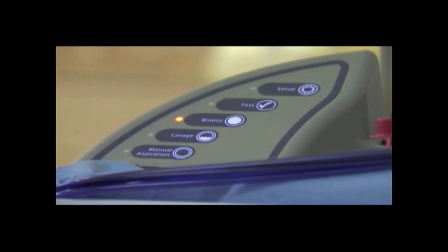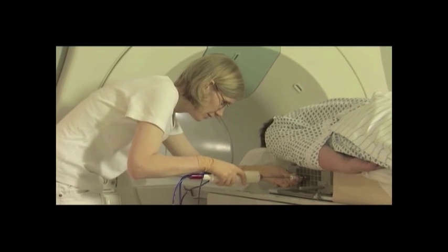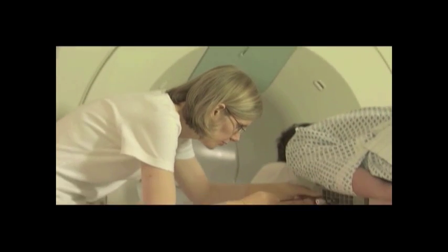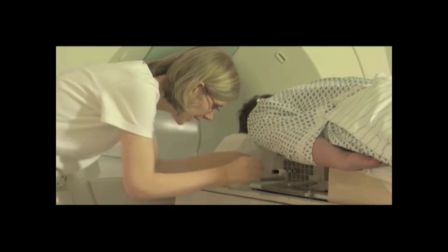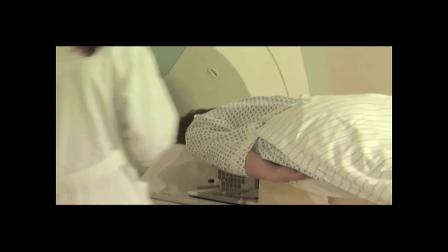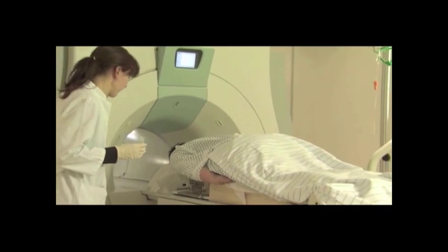Switch the console back to biopsy mode by pressing the button marked Biopsy. Remove the Atec handpiece while leaving the introducer sheath in place. To verify the successful biopsy of the area of interest, reinsert the localizing obturator back into the introducer sheath. Shuttle the patient back into the magnet for post-biopsy sagittal and axial image sequences.